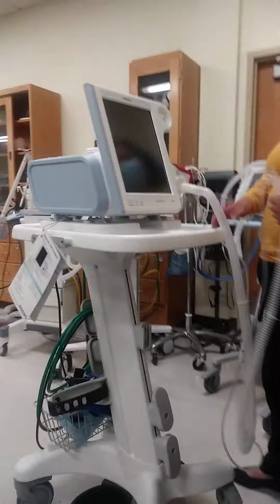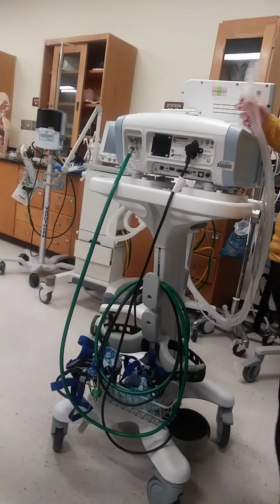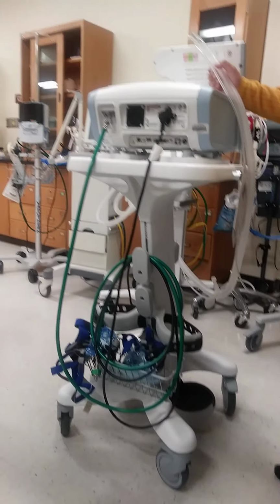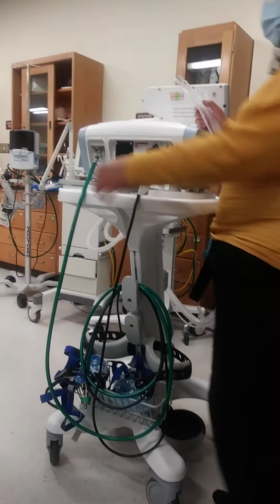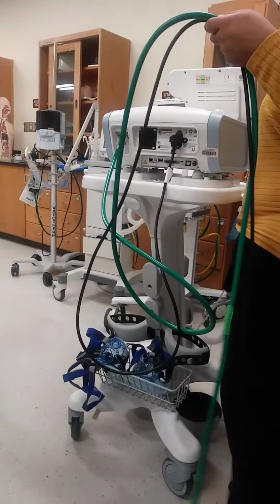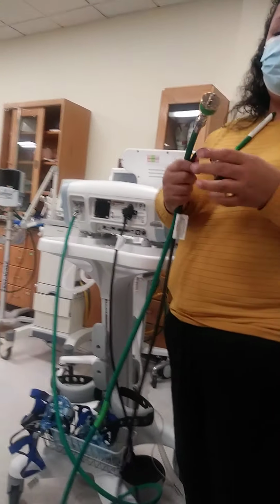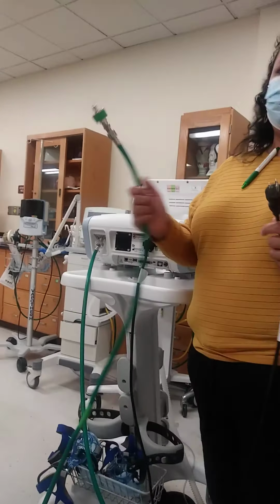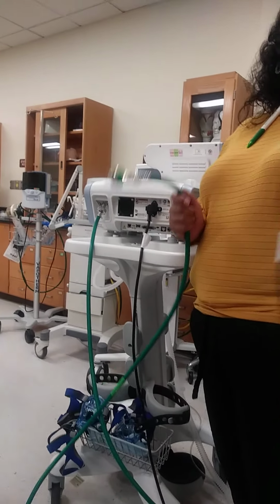Okay, so the back of it. What do you guys notice with the tubing? It's just connected to the oxygen and then the power port. This actually is connected to the wall outlet. And it's green, so it goes to the green one, okay? And then this is the power cord, okay?